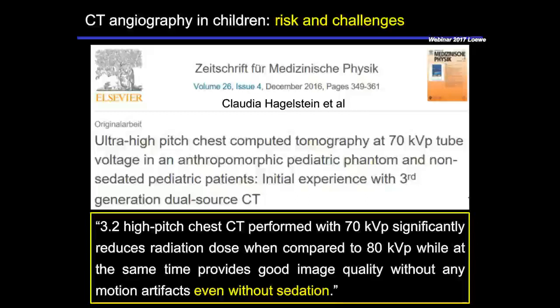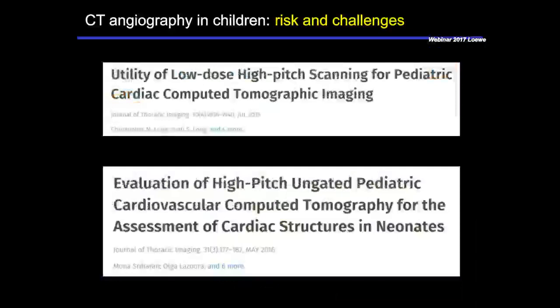It becomes critical between the ages of 4 and 8 years. Then you need some kind of sedation. But in the very small children and neonates, where sedation is the most critical issue, it's not mandatory anymore, because the acquisition is that quick, and there is very good evidence that you can safely do that without sedation.